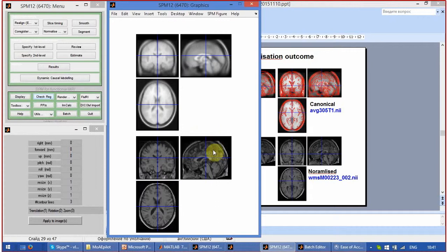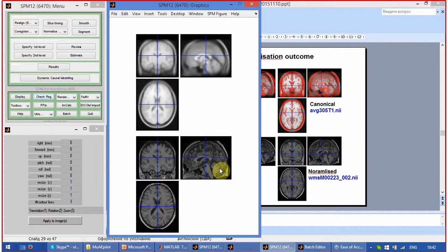You will see now the shapes of the brains, the canonical and the sample, are very similar.